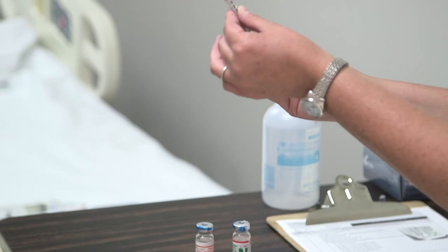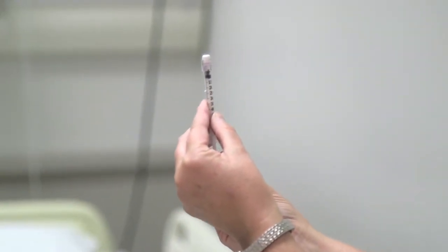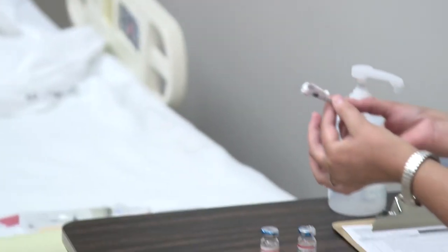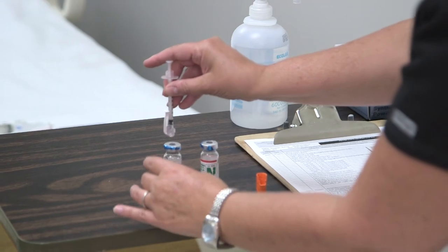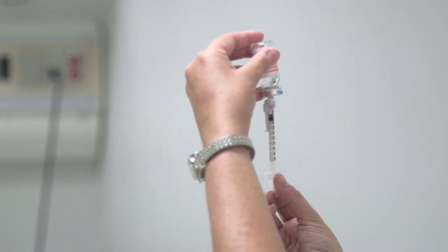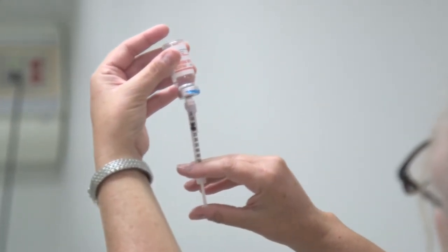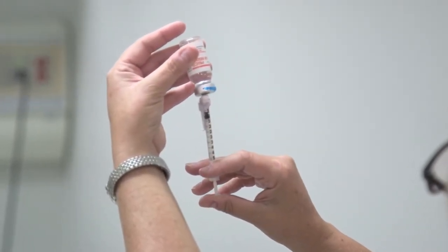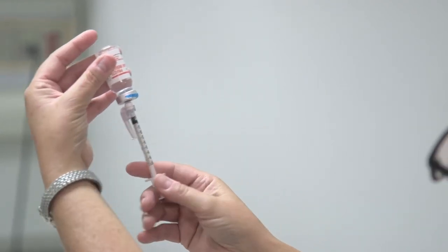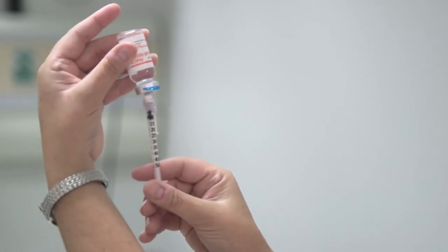Now I'm going to do my five units of regular. I draw up five units of air and inject that into the vial of regular, then proceed to draw up my five units. Sometimes I draw out a little extra to get all the air bubbles out, then adjust back to five units of regular.